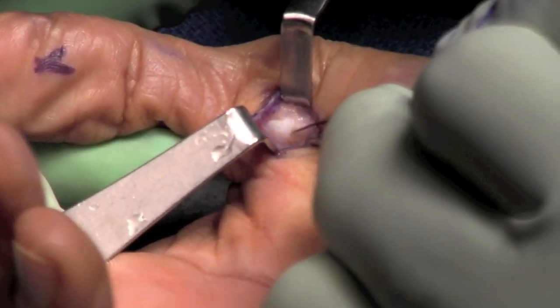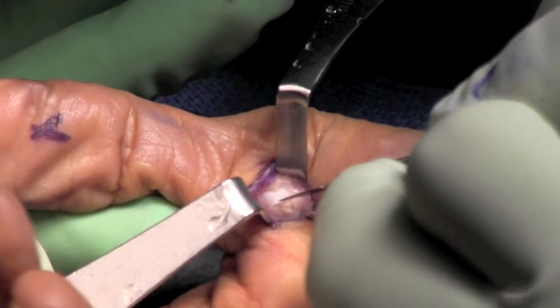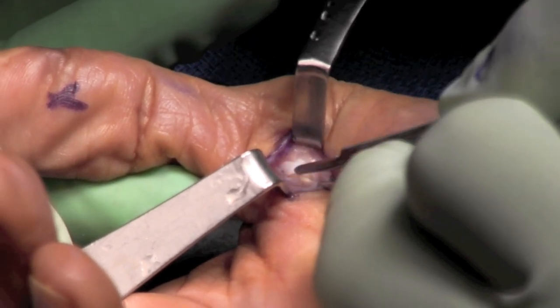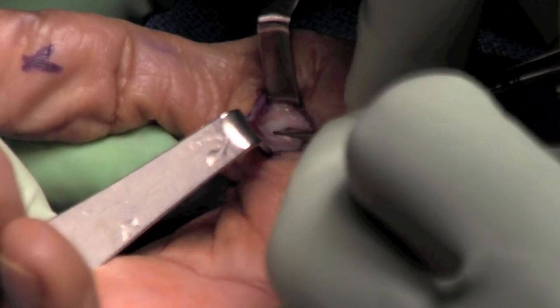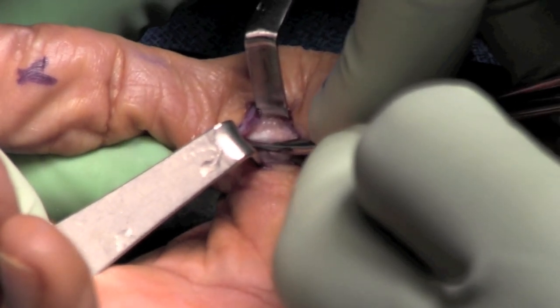We will use a knife to incise the proximal edge extending distally. Here we can see the pulley begin to open. We then use a tenotomy scissor to complete the release distally.